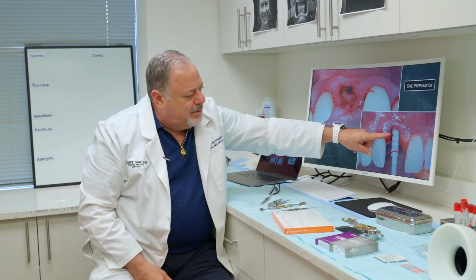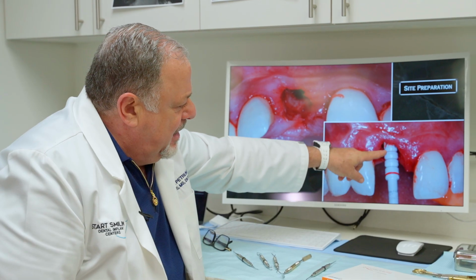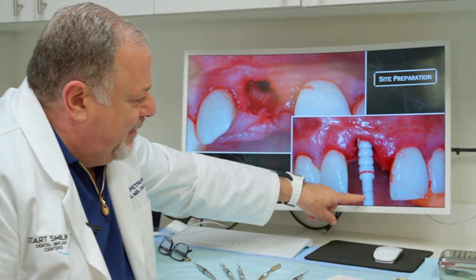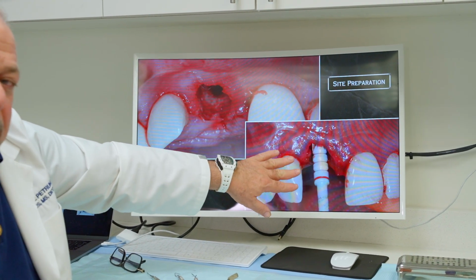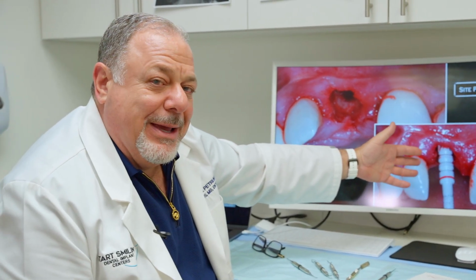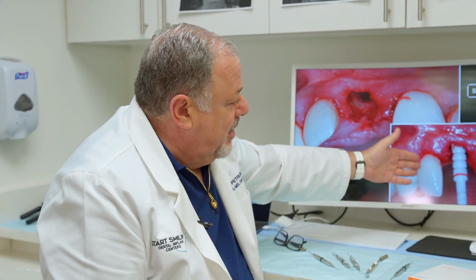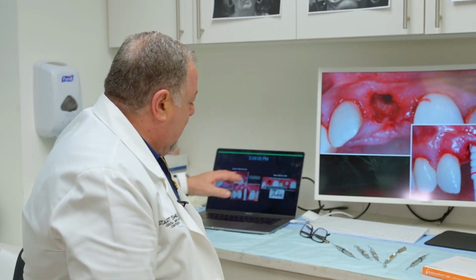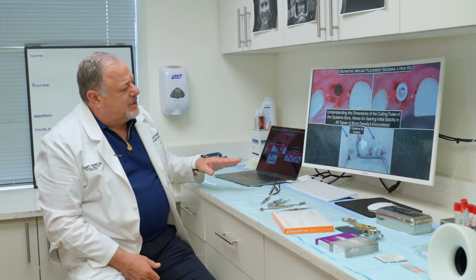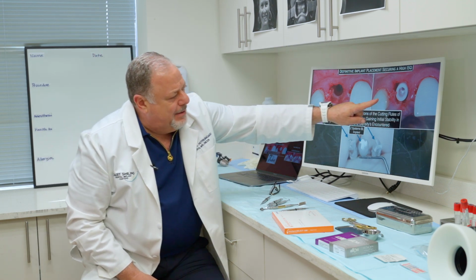These are also measurement devices on the implant itself. So if I go to here, this is my 12 millimeter mark. And if you're a deep tissue, you even have them here. So these are the drills that never dull. I've been using the same drill kit, well, 2 or 3 kits, but we've been using them going on almost 5 years now, okay? And they're as fresh as they were the day that we used them for the first time, okay? Now, as you start to see, this is the Z-Systems bone level implant, okay?